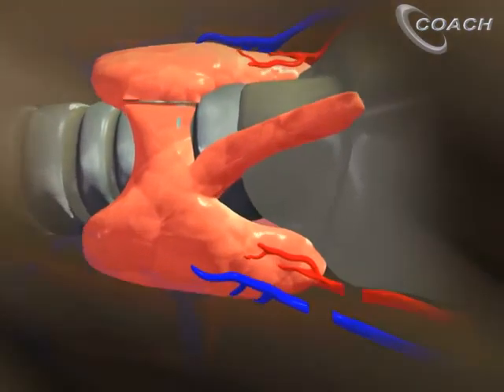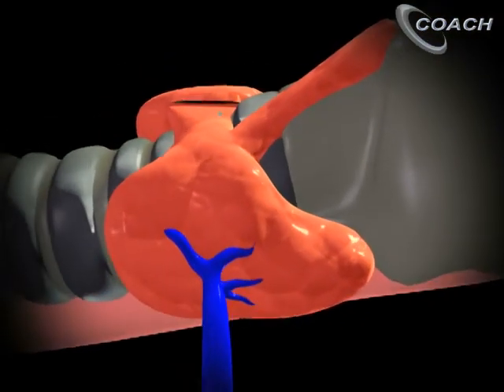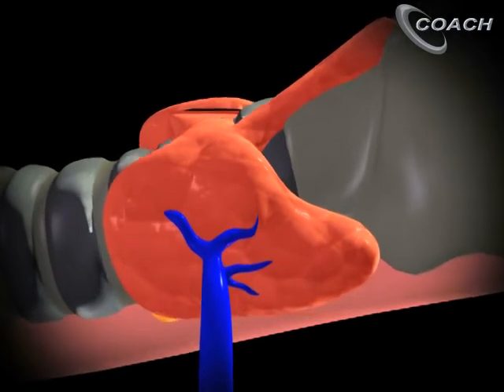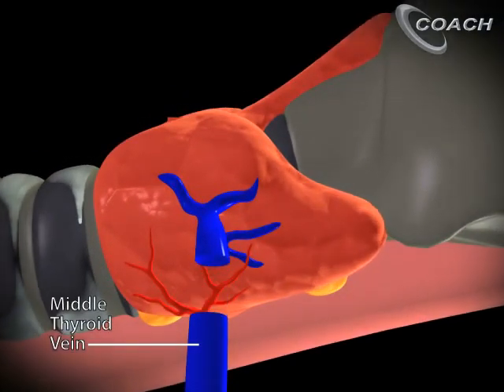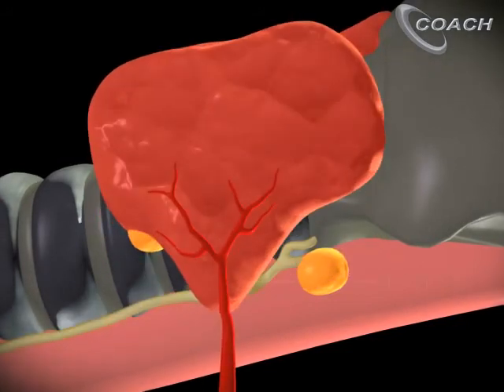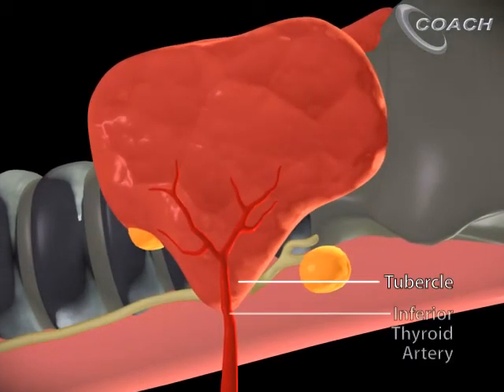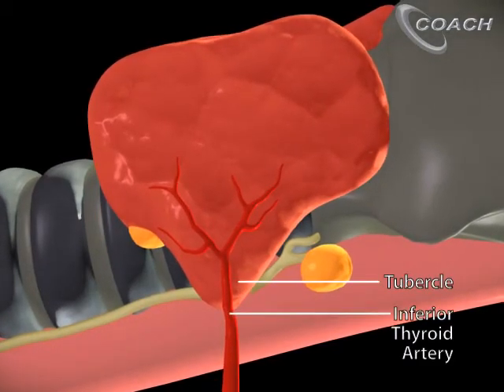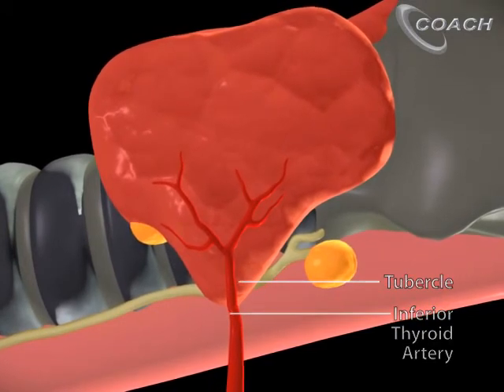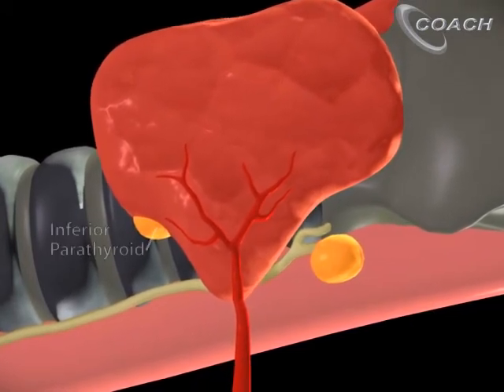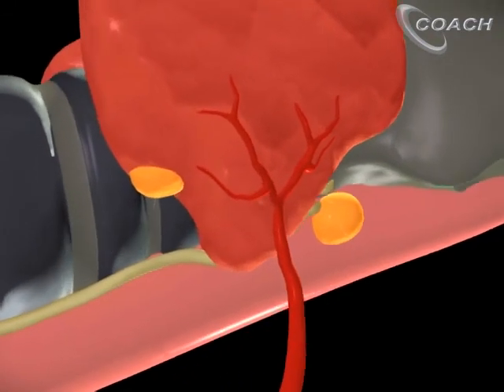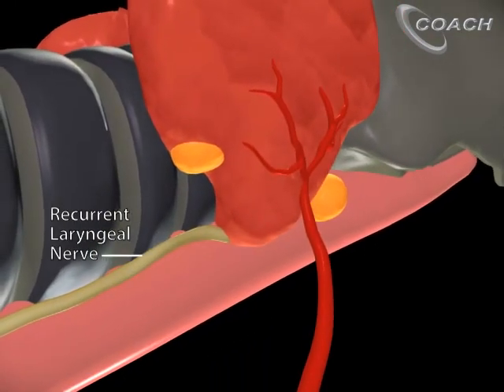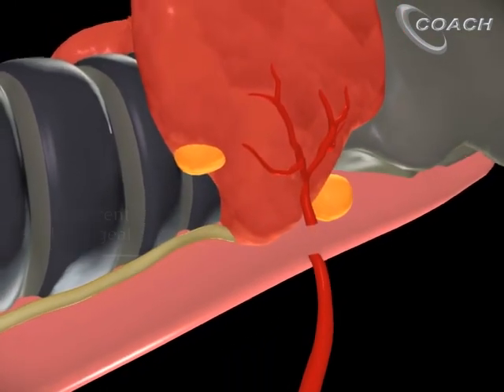We'll rotate the thyroid anteriorly and medially. This will help us identify the middle thyroid vein, which we'll divide. Next, we'll identify the tubercle of the thyroid and the inferior thyroid arteries, which typically enter the thyroid at the tubercle. From here, we identify the inferior and superior parathyroid glands, identify the recurrent nerve, and then divide the inferior thyroid arteries.